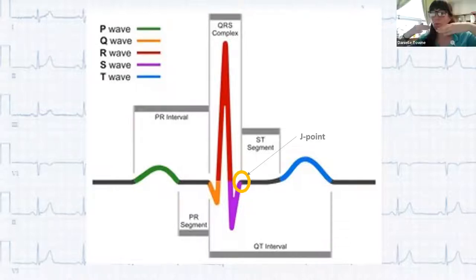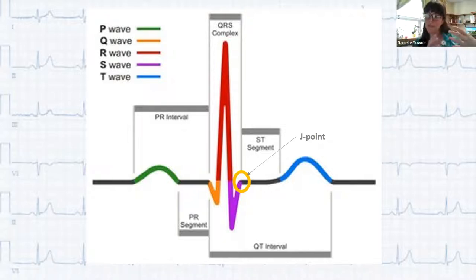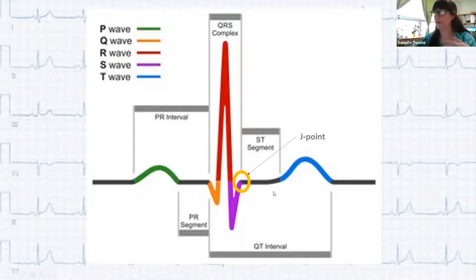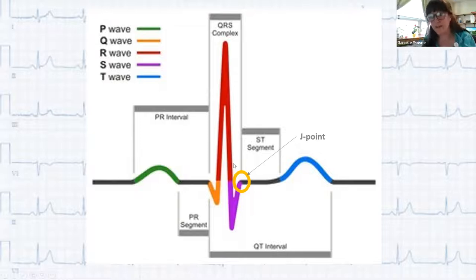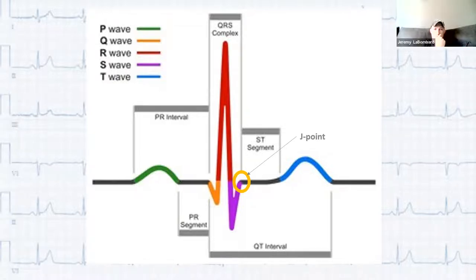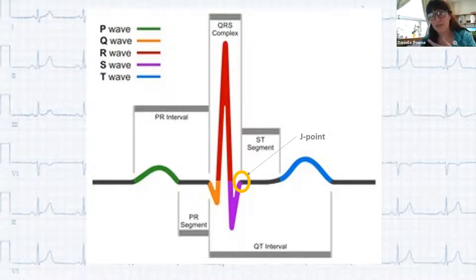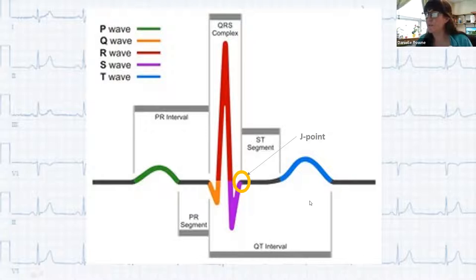Another important point that doesn't always get talked about is the J point — the junction between the end of the QRS and the beginning of the ST segment. It's the end of the depolarization phase and beginning of repolarization. We'll see talk of J point slurring later, which essentially means having an issue moving from depolarization to repolarization. The J point sits right between the QRS and the ST segment.